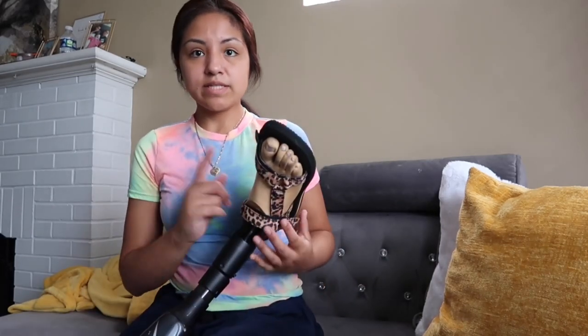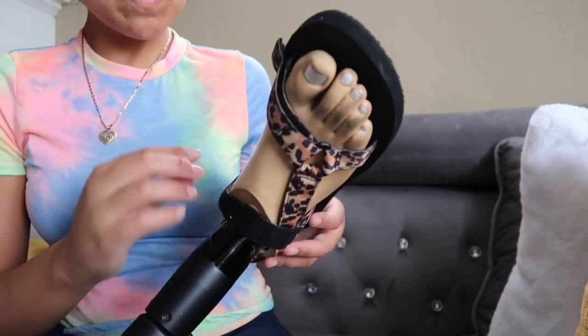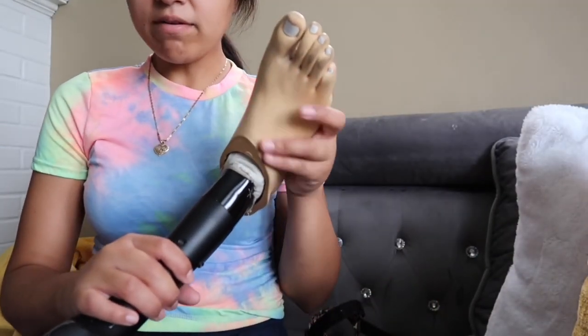Another way I use the rotator is putting on and taking off my shoes. So again, I press the gray button, twist it. I'm going to take them off. These are my sandals. Let me put you guys a little closer. So these are my sandals. I'm taking them off. I took them off. That's the way I take them off.